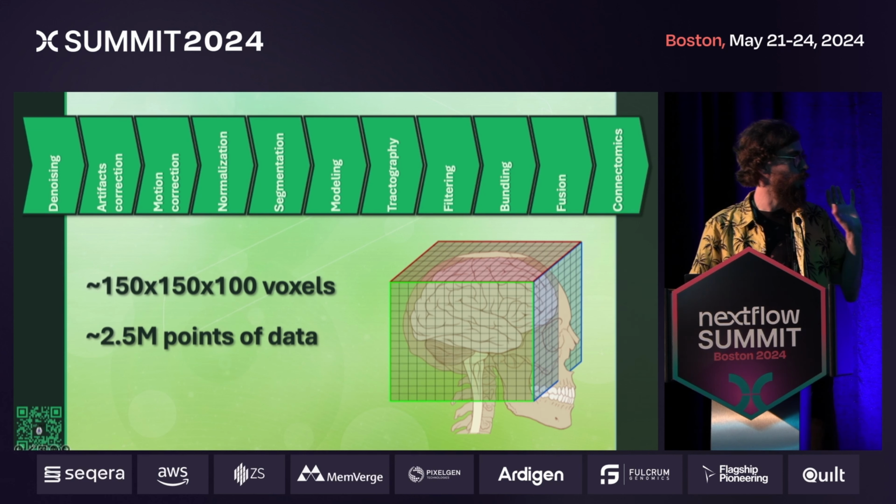And it's not all. Our goal is to reconstruct neuronal pathways, and so we use an algorithm called tractography, which produces millions and millions of potential connections, each sampled at tens to hundreds of 3D points. And those we further analyze using filtering algorithms and clustering. We fuse those with other types of information, most of the time in resource-hungry, really high-dimensional frameworks. So I don't think I need to say more on that. Diffusion MRI is really hard on the computer. It tends to break in most HPC or even local setups that we have. But when we're clever, we do the work well.